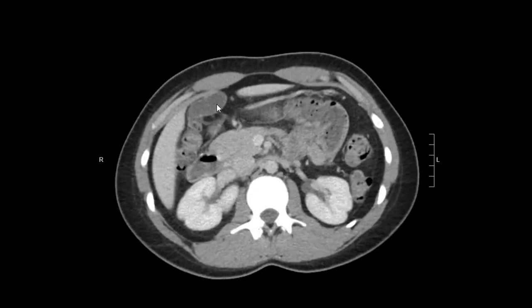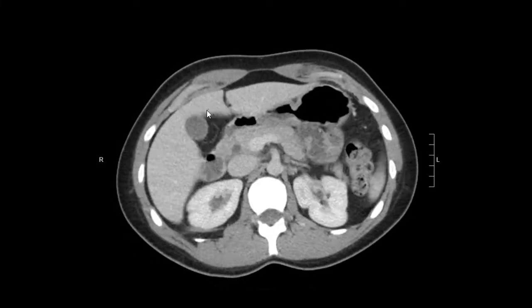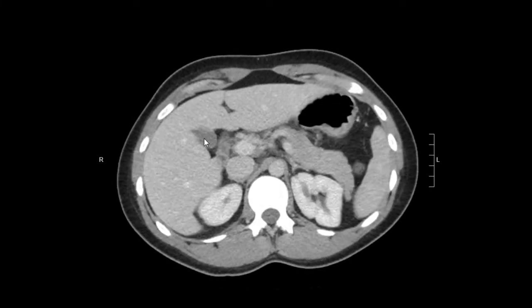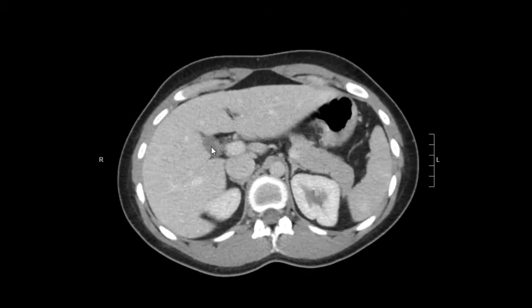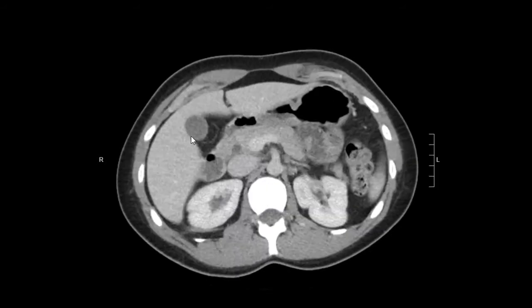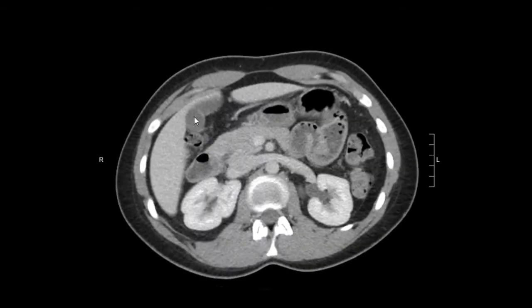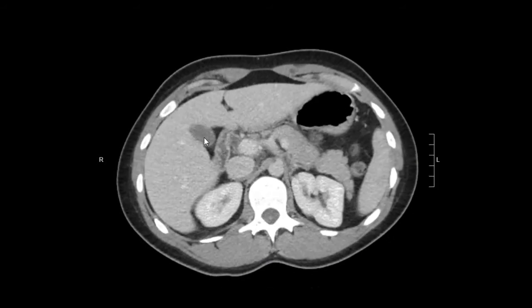Moving on to the gallbladder. Over here, this fluid-filled sac — that's normal. No gallstones, no gallbladder wall thickening, nothing like that.